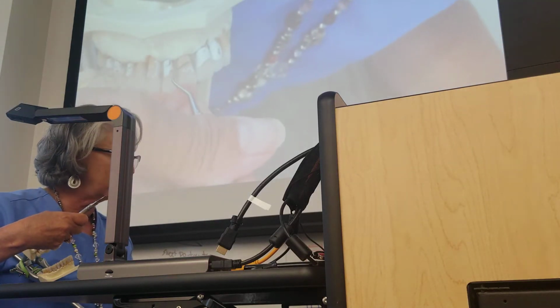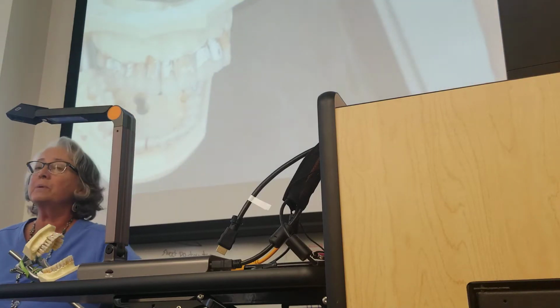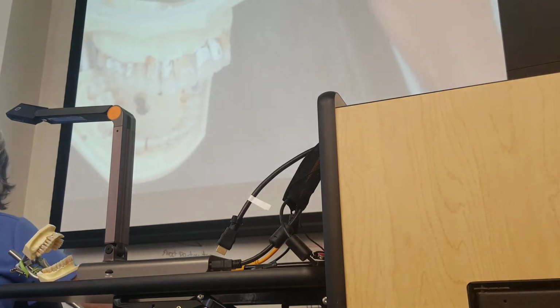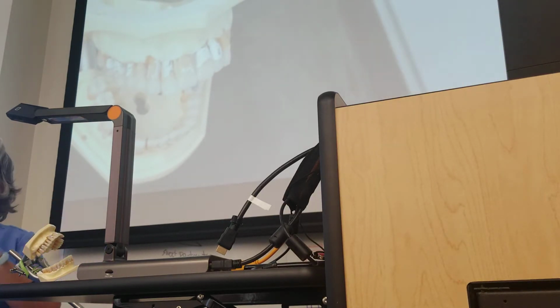Insert the working end to the base of the pocket. Okay, now there's something more that we need to add here. We always want to insert as close to 0 degrees as we can. What I mean by that is you want the face of the blade as flat to the surface as you can get it. That does not mean you will have this completely flat on the tooth surface, but just as close as you can.